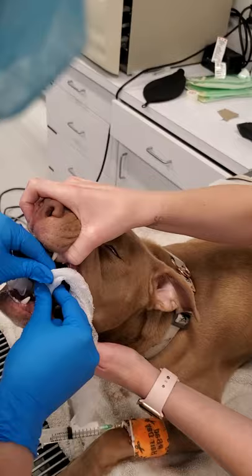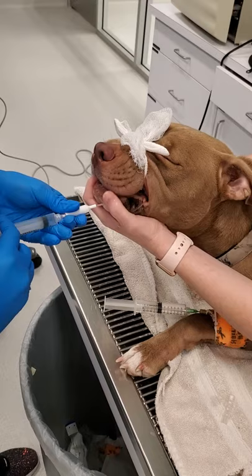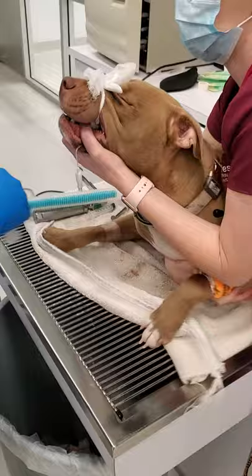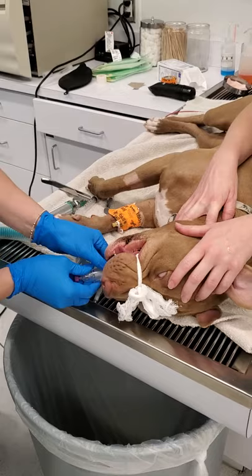Once she has the tube, I'm going to go ahead and close her mouth so that she can't cough out the tube. I'm going to hold on to her head as I flip her to the side. I'm going to turn the oxygen on and connect her.